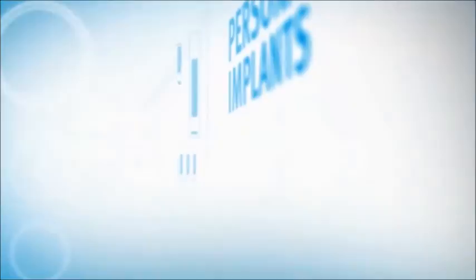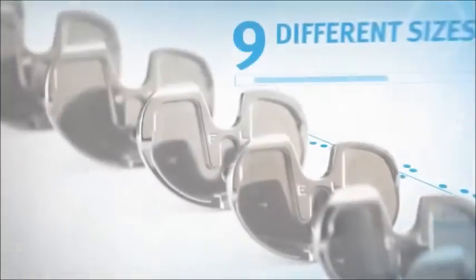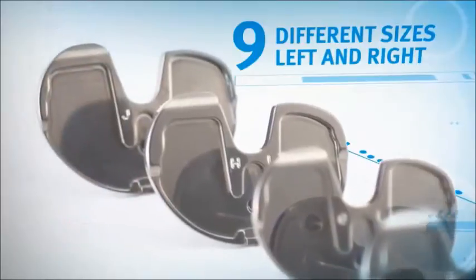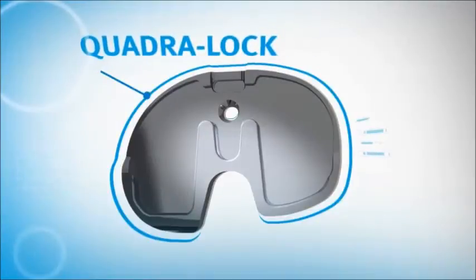The Persona tibia has been enhanced in almost every possible way. Its anatomic design is not just asymmetric — it's much more sophisticated. A new, best-in-class locking mechanism: our proprietary QuadraLock.